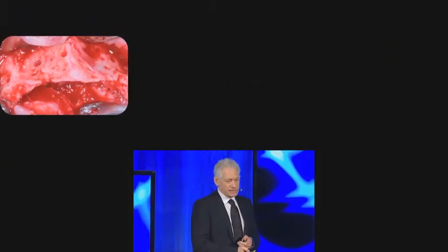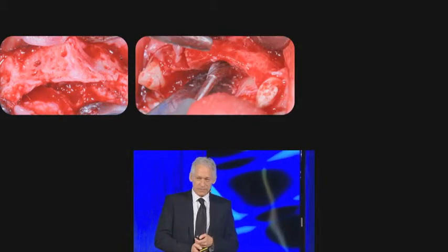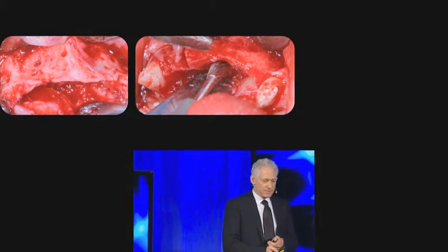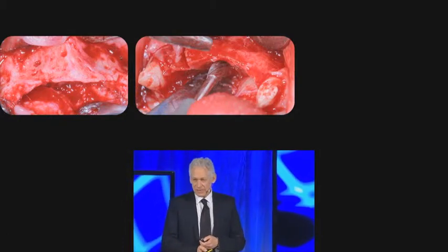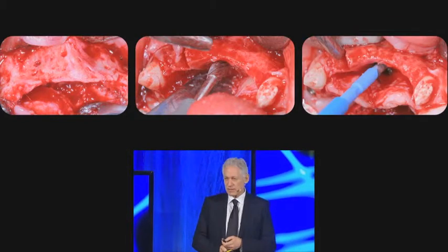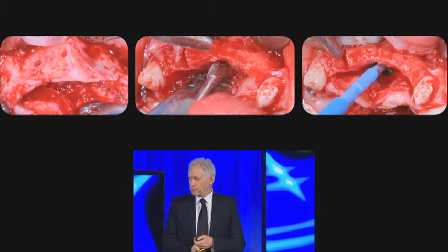Once this is created, I do practice intramarrow perforation. Anything that will limit optimal placement of implant will be removed. So in this case, we have an incisive foramen, which is very prominent. It will be grafted. If it will be grafted, I have to remove it, remove all soft tissue and smooth it up. And that's exactly what we do. So we often will graft facially, and we will be grafting lingually.